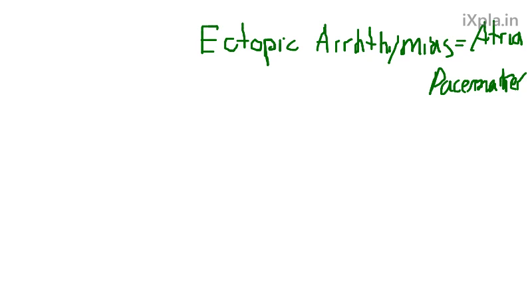Now, to go over really fast: whenever you look at an arrhythmia, you can tell what it is. You always want to define 4 things of an arrhythmia. Based on these, you can tell if it originated in the atria or in the ventricles, and there are certain different arrhythmias that do this. You also look at the pattern to see the rhythm, and at the ratio of P waves to the QRS complex. Those are the things you always want to look at.